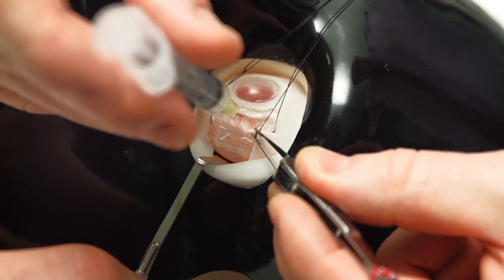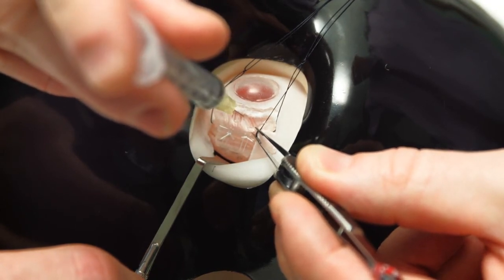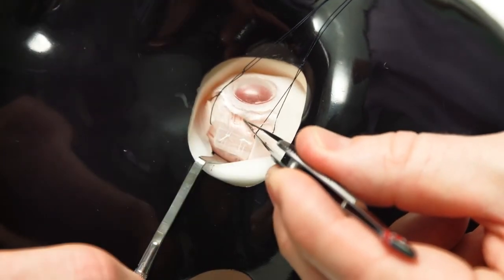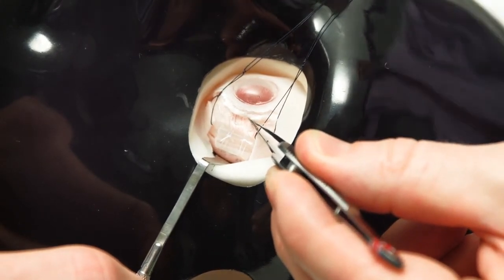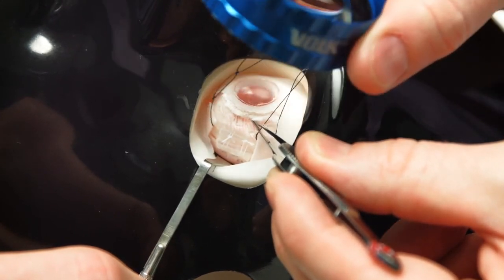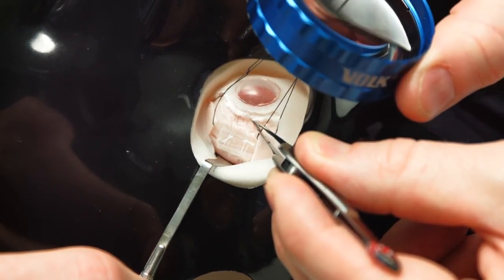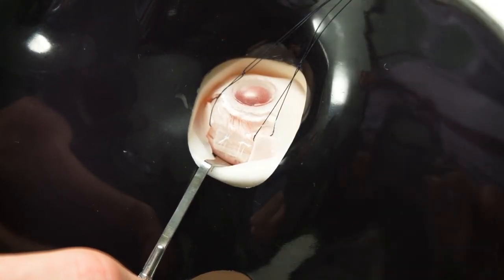The tip of the needle is visualized with an indirect ophthalmoscope, and when it's seen inside the eye the needle should be pointing posteriorly, not towards the lens, and a single movement made to inject a single large bubble. Ideally the injection point should be the highest point of the eye so that the bubble will form downwards from the needle.